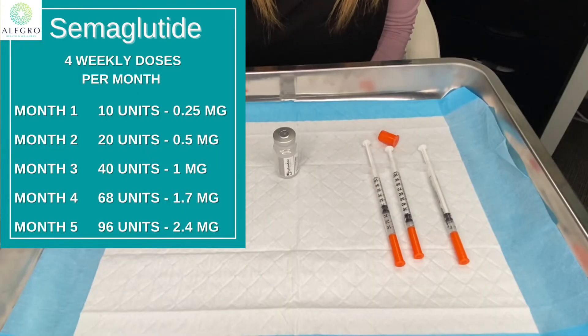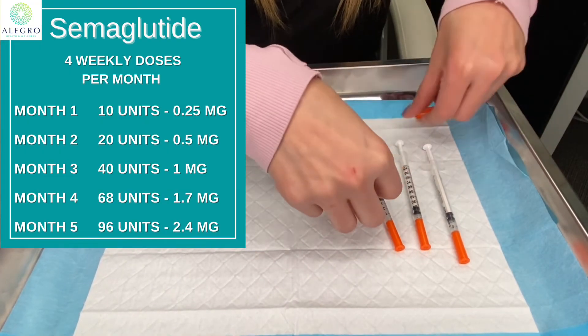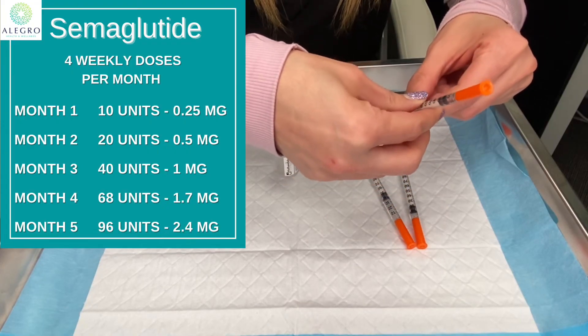Again, it's not recommended to pre-fill your syringes. You want to draw up the medication from the vial before you inject each time, because the dose may be adjusted for you. If you pre-fill all your syringes and your dose changes, you're going to have pre-filled syringes with doses that are incorrect for you.